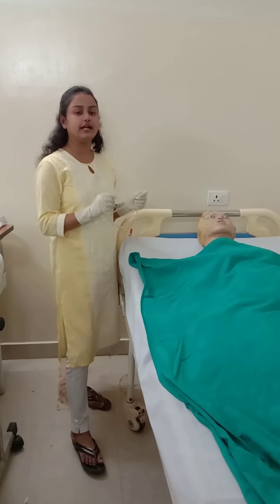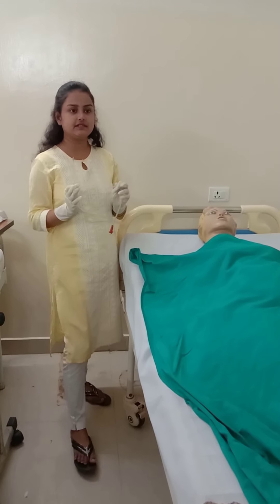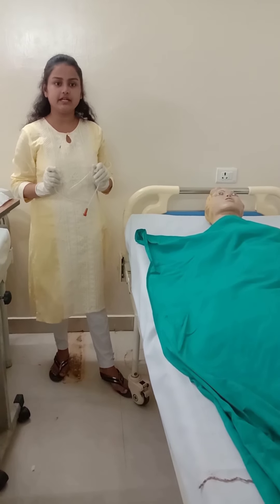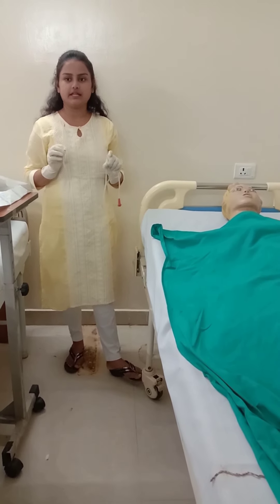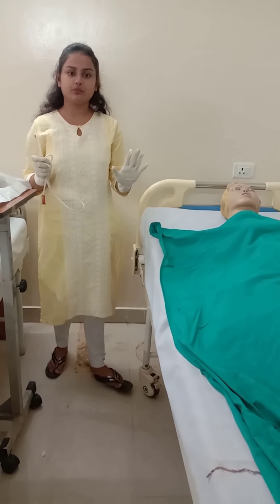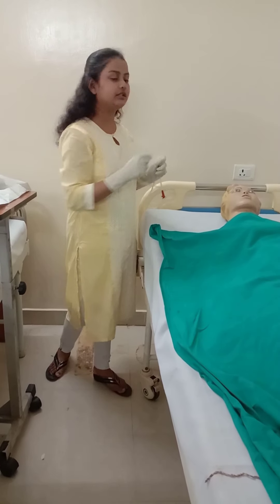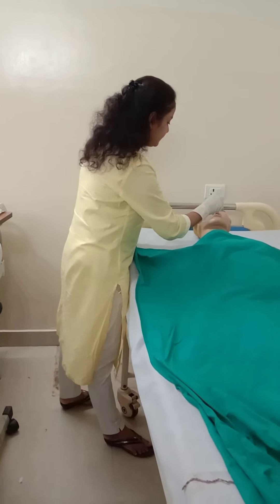Before inserting the Ryle's tube, you have to measure at what point you need to insert it. I have already explained the measurement technique in a previous video — from the tip of the nose. To insert the Ryle's tube, elevate the patient's head to 30 to 45 degrees. Next, lubricate the Ryle's tube so that you can insert it very smoothly.